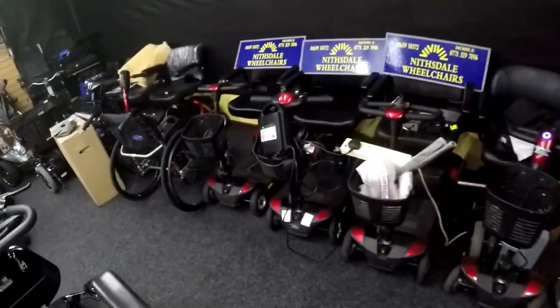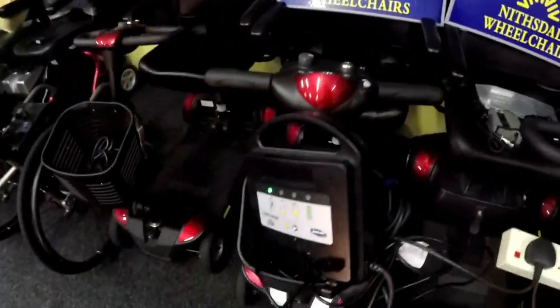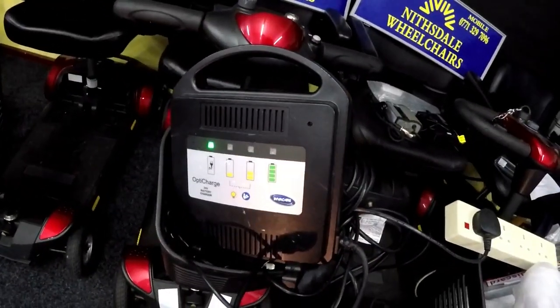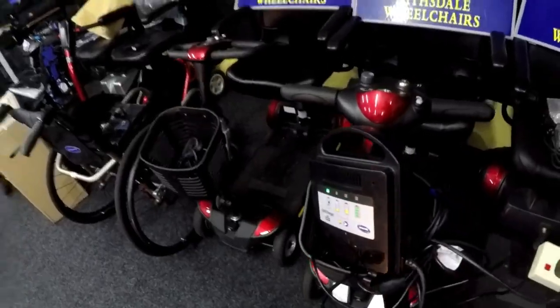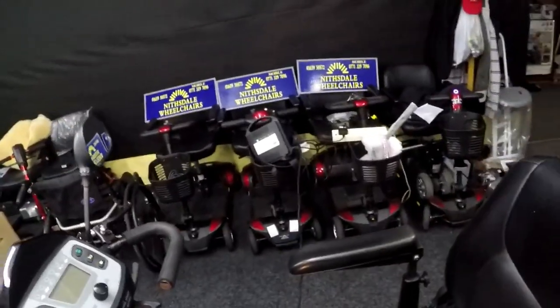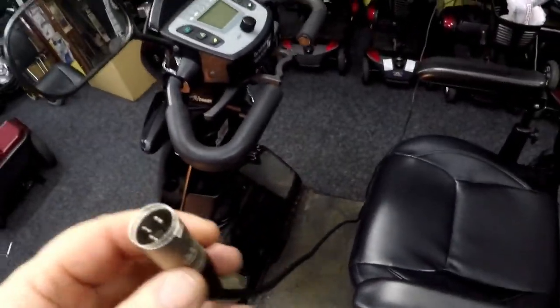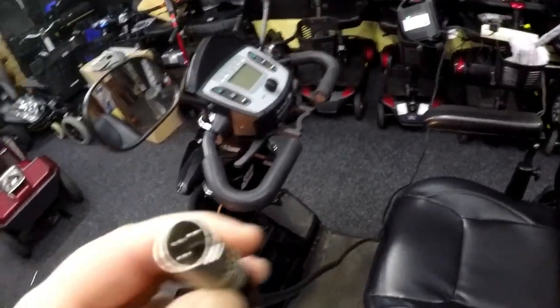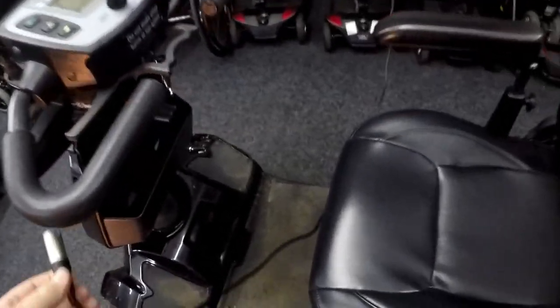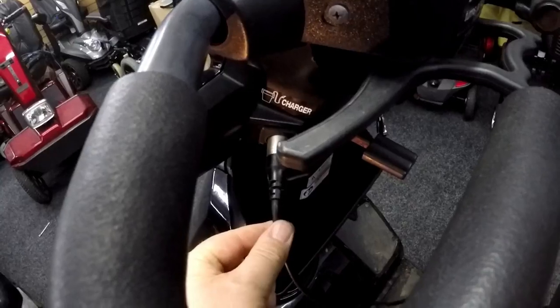Now he issued a good quality 8 amp charger, an Invacare one, usually issued with Invacare products, not the Rascal Vision. So he's been swapping chargers about, but usually you can do that. But specific with the Invacare charger, this particular connection here is a slightly smaller connection, so it is actually quite slack.